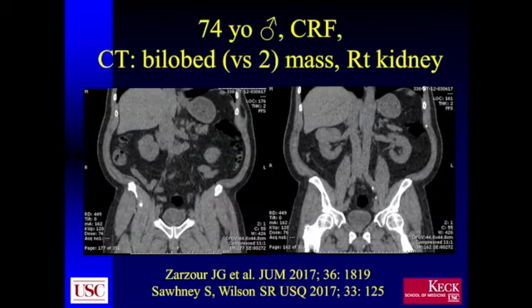As I mentioned, there are two recent articles that have been published just this year looking at the comparison of non-contrast CT or MR in characterizing renal masses, and clearly contrast ultrasound outperformed non-contrast CT or MR, and of course grayscale ultrasound as well, at characterizing renal masses.